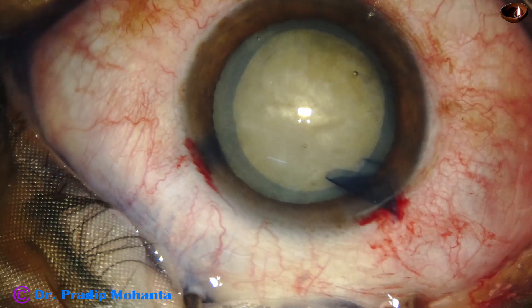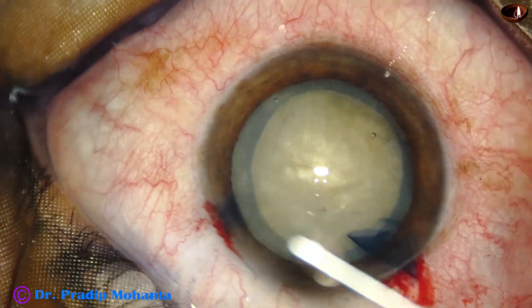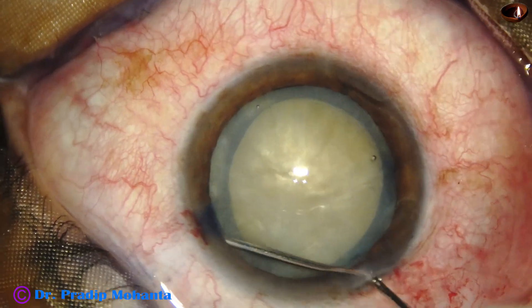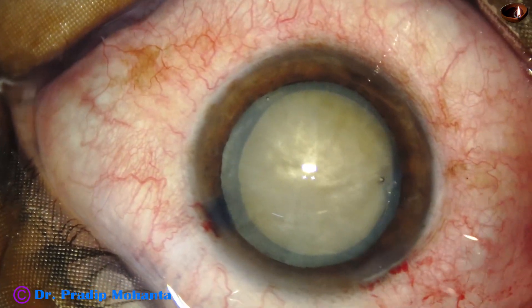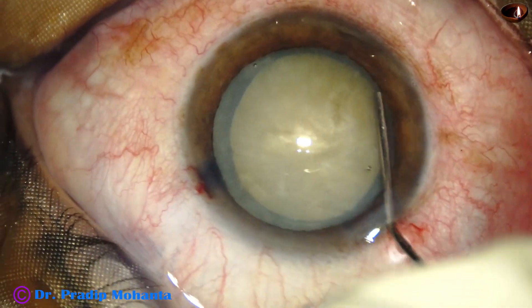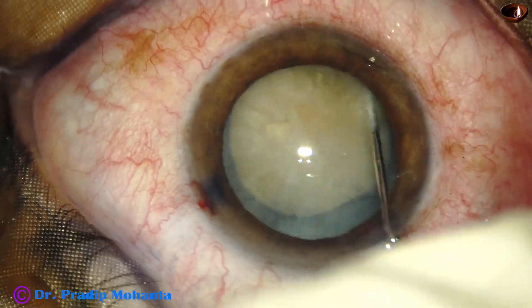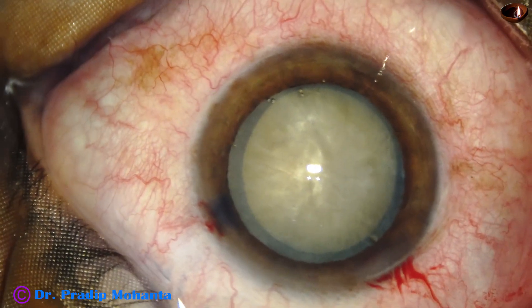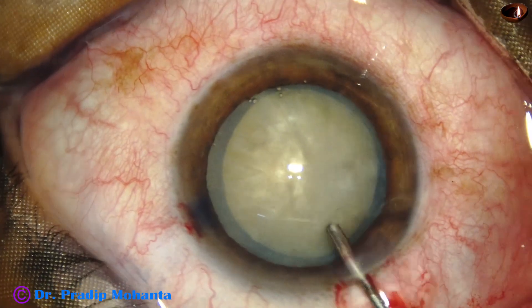Since the nucleus appears quite hard, the rhexis size is about 6 millimeters. And now hydrodissection is done and the nucleus is mobilized. And now the anterior chamber is again filled up with visco.